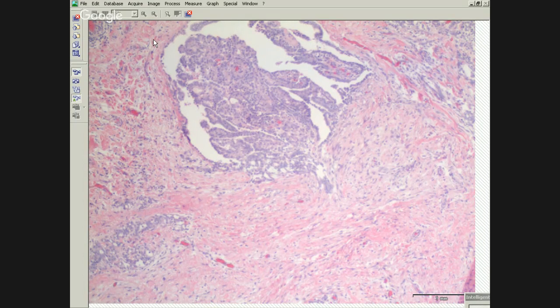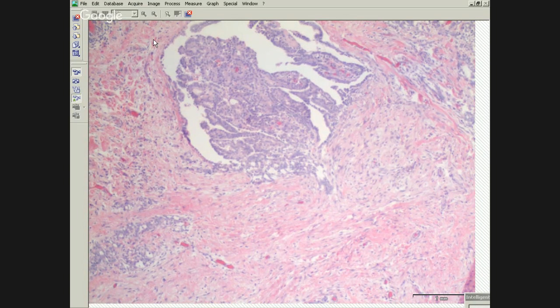So most of the time it's going to be mesothelioma versus lung adenocarcinoma, but there are some pitfalls to keep in mind if you are considering other types of metastatic tumors. And this is not the place to be cheap. The US and Canadian mesothelioma panel generally recommends a minimum of 2 quote unquote mesothelioma markers and 2 adenocarcinoma markers.